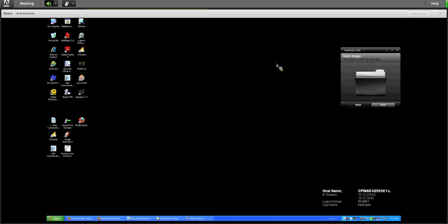And one of the more unique things about the system is, as opposed to going in and saying search, file, open, go to my C directory, look in this particular folder, all the things that we're used to when it comes to computer programs, imagine this is an app. It's a program running on top of the program. And it simply does a screen capture of whatever's on your screen.